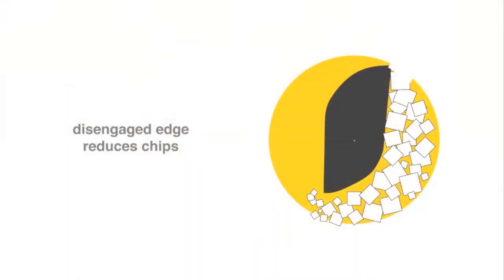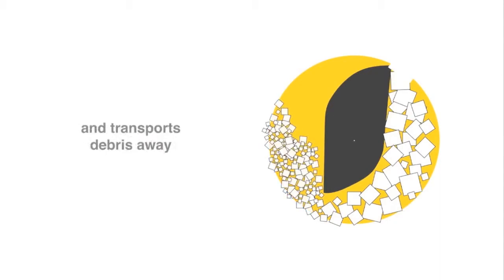Debris removal is more effective since all cutting edges are not simultaneously engaged. The cross-section area decreases proportionally toward the handle end of the file and increases the area for debris elimination. In addition, the cutting edge that does not engage the canal wall as forcefully as the opposing edge acts to break up the debris, facilitating its removal.